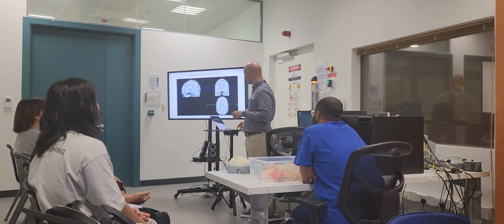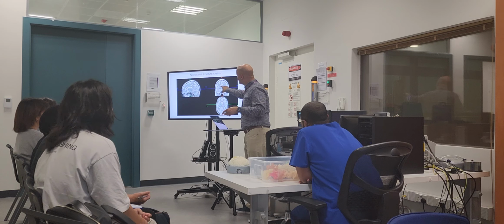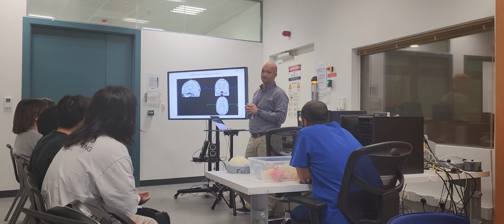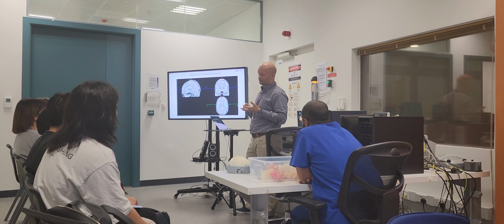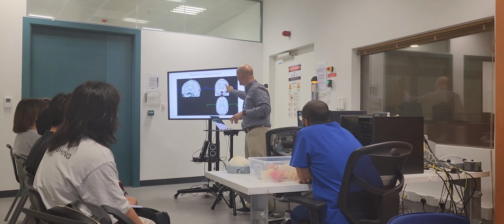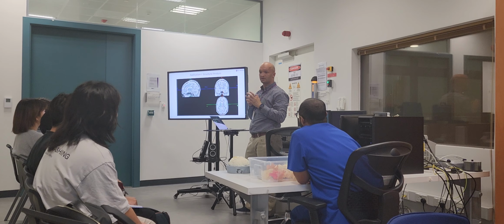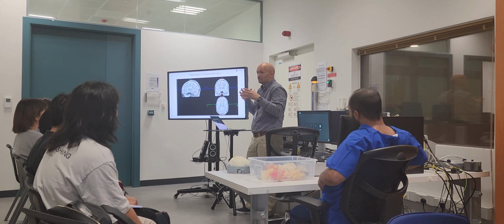Okay. So what is this bright stuff around the brain? It's fluid. It's called cerebrospinal fluid. It is used to maintain pressure, remove waste, and so on and so forth. You can remember the brain is fixed in the skull. You see this black thing? This is actually the skull. And the brain is trapped inside that skull.